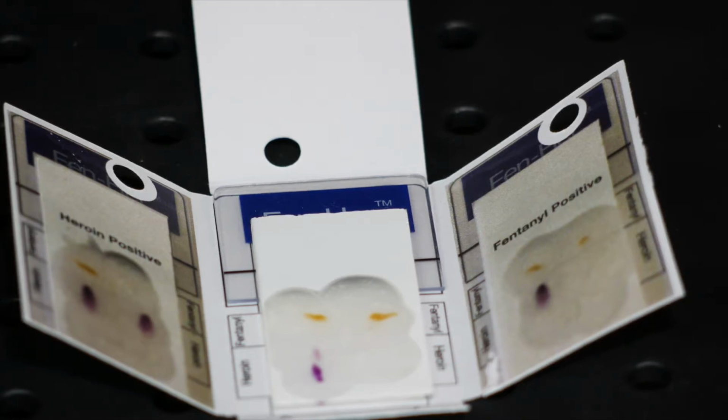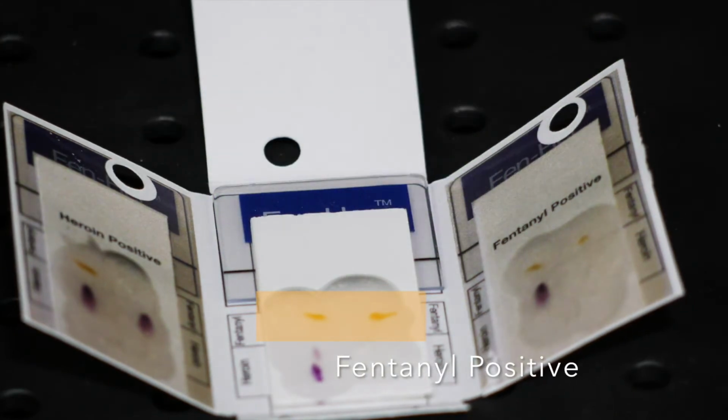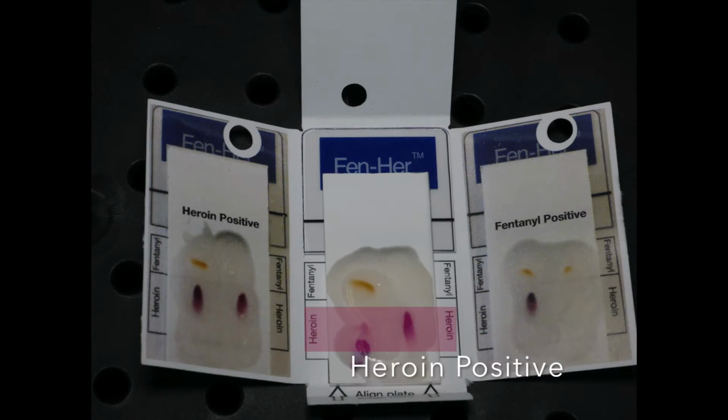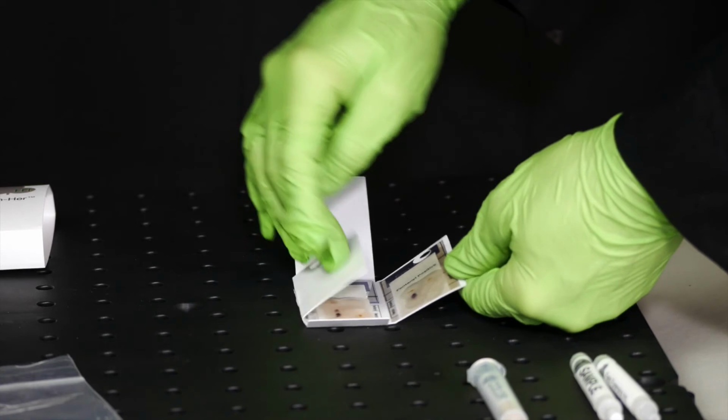Verify the plate is aligned with the diagram in the wrapper. Use the diagram to determine the presence of heroin, fentanyl, or other materials. Take photos of the plate, since colors will fade and change over time.